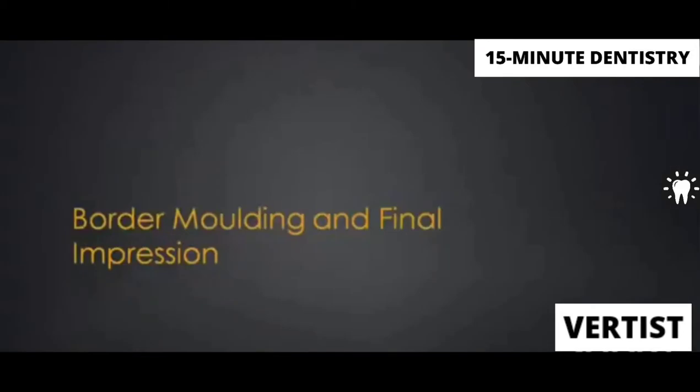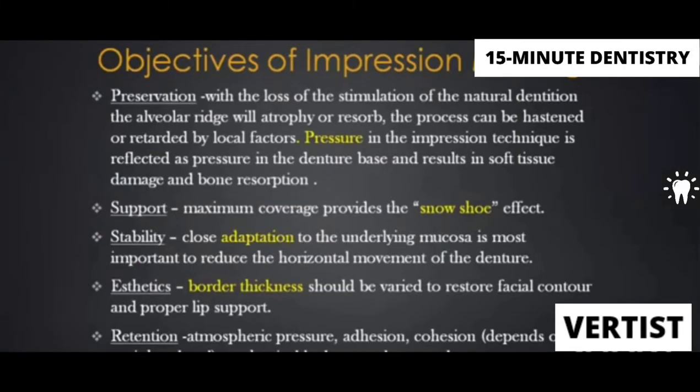Now we'll come to border molding and final impression. Very quickly, I'll speak about a little theory. What are the objectives of impression making? All of us know: preservation, support, stability, aesthetics, and retention.